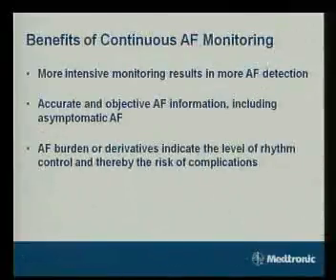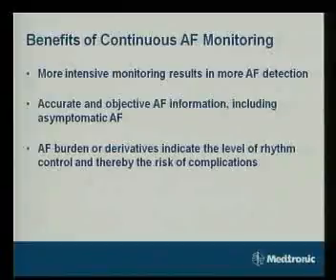So the benefits of continuous AF monitoring is you will find more, you really have a true impression of the AF status of the patient. That includes asymptomatic atrial fibrillation. And of course you can use it also to see how effective your therapy is.